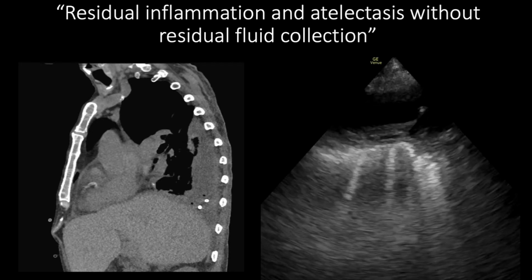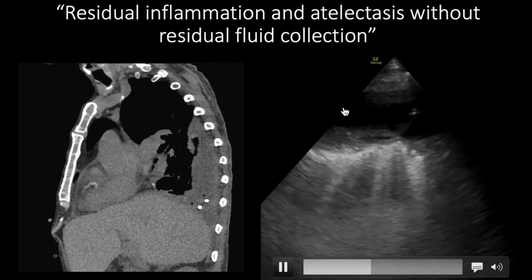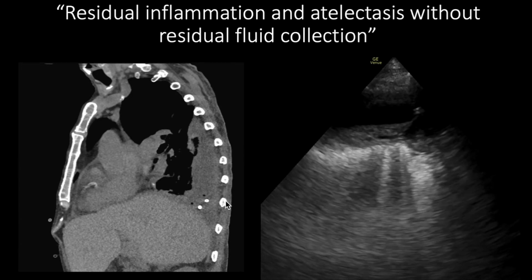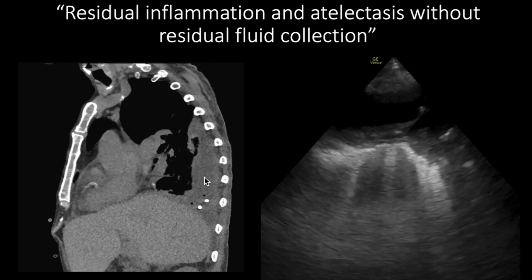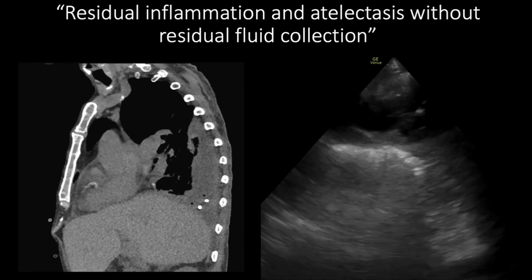But when we place the ultrasound here, we can see there's still a residual fluid collection. This black anechoic fluid is consistent with more purulent material that has yet to be drained. Because this patient wasn't given IV contrast, it's hard to delineate what is atelectasis and what is residual empyema. But with ultrasound, it's very clear. He needs more drainage of this pus, if at all possible.